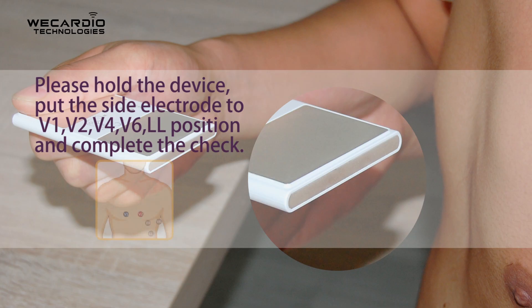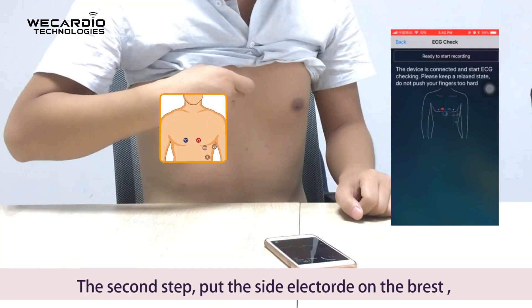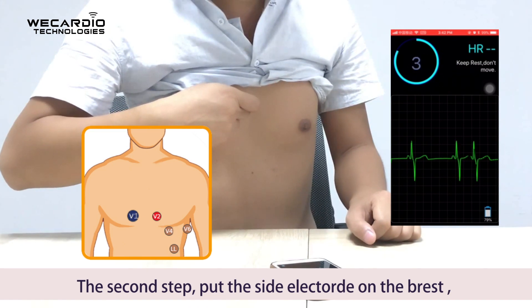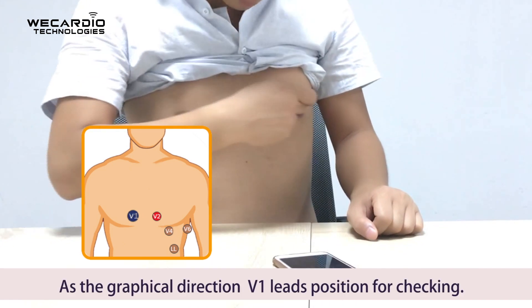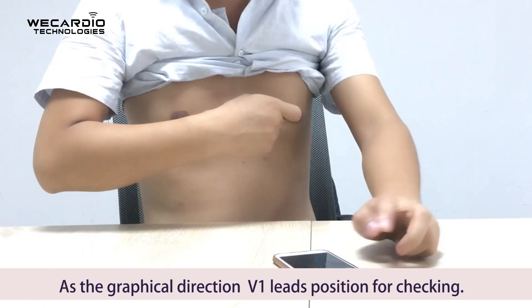Please hold the device and put the side electrode to the V1, V2, V4, V6, and LL positions to complete the check. Second step: put the side electrode on the chest and touch the flat electrode with your hand. Follow the graphical direction for the V1 leads position for checking.